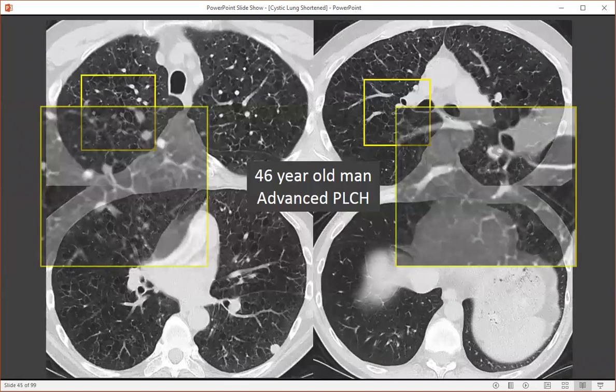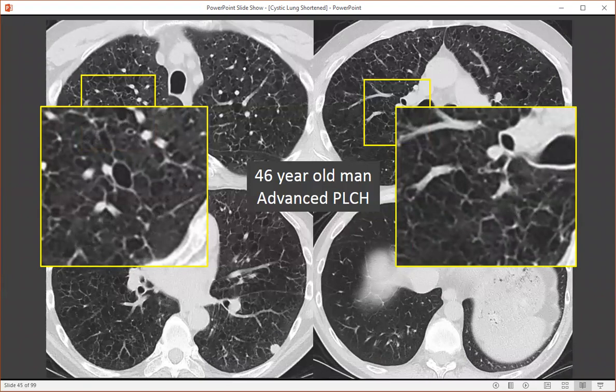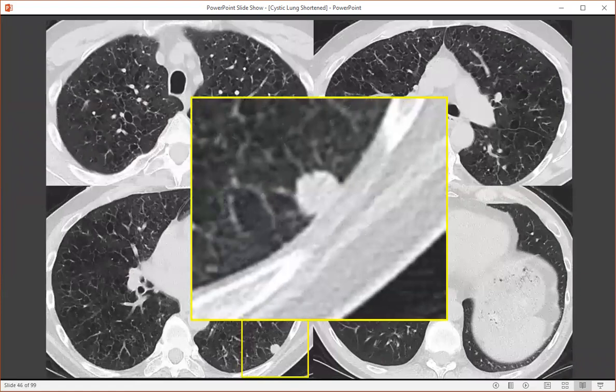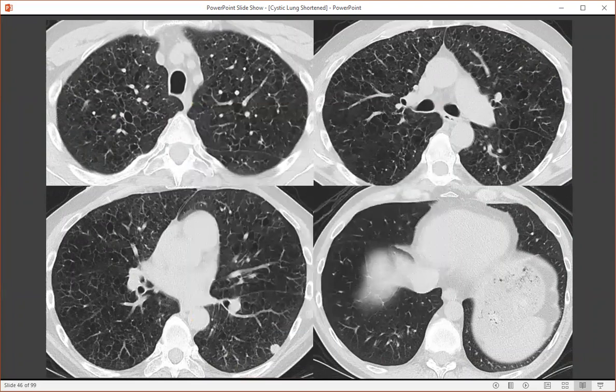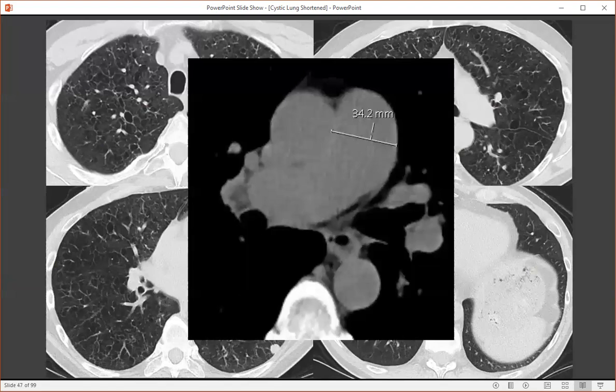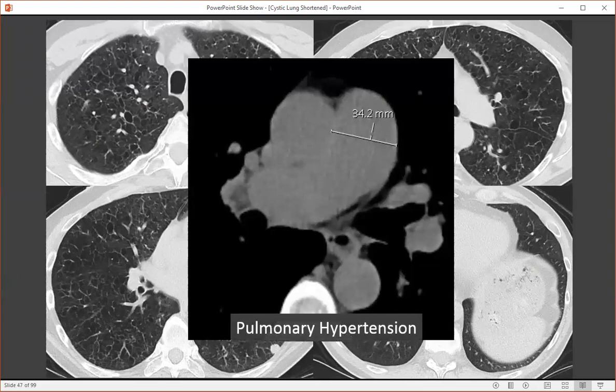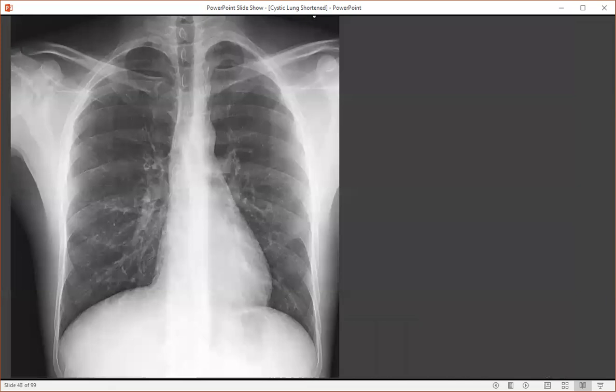This is a 46-year-old man with advanced pulmonary Langerhans cell histiocytosis, and we can see this person has progressed to these bizarrely shaped cysts, predominantly in the upper lung zones. You should also keep a lookout for lung cancers, as these are smokers. This person was subsequently diagnosed with a non-small cell lung cancer. Another associated complication of PLCH is the development of pulmonary hypertension, which often drives people to lung transplantation. This person did have a moderate to severely dilated pulmonary artery in keeping with pulmonary hypertension.